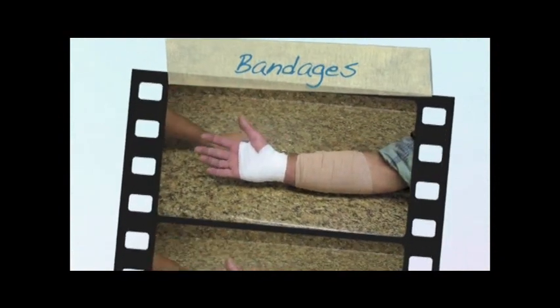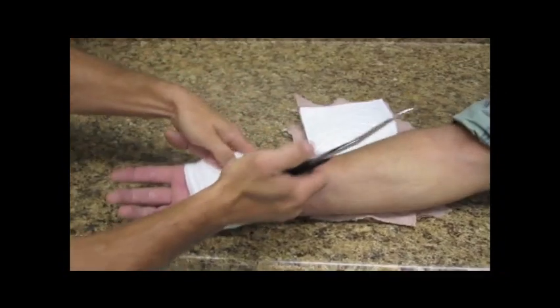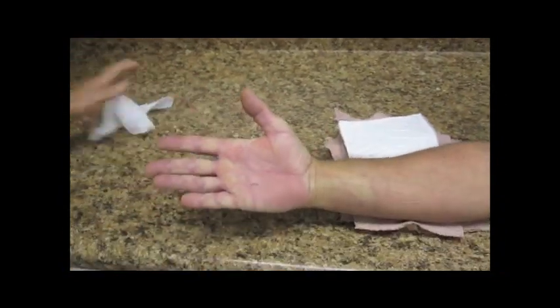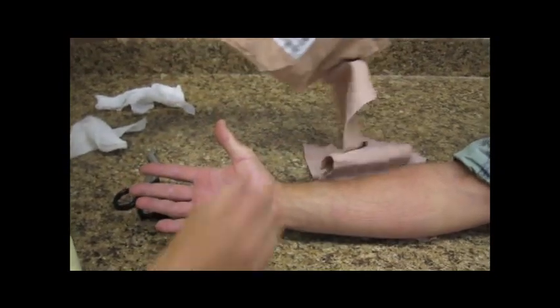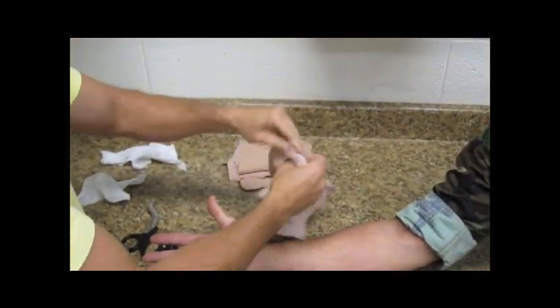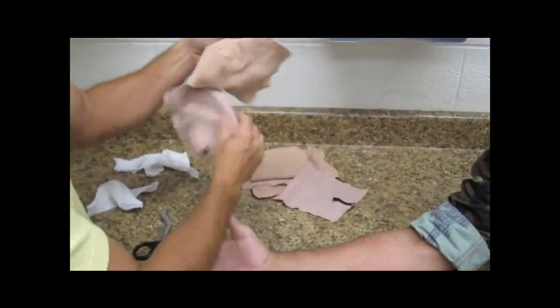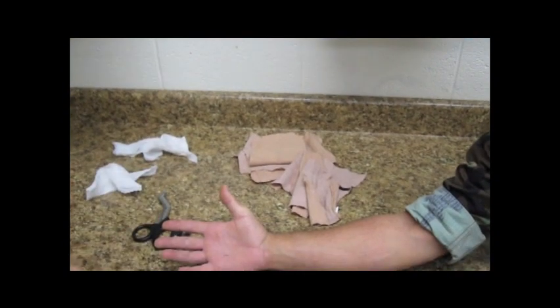You can see how easily the guide slides underneath the bandages for easy removal. We count here 1, 2, 3, 4, 5, 6, 7 layers of fabric.